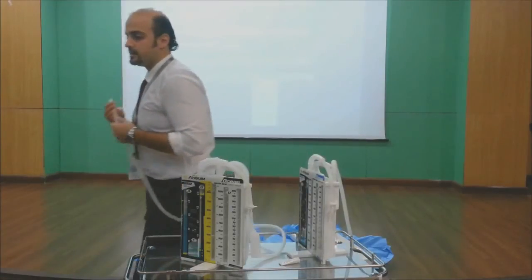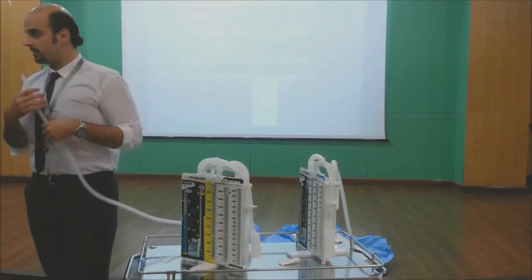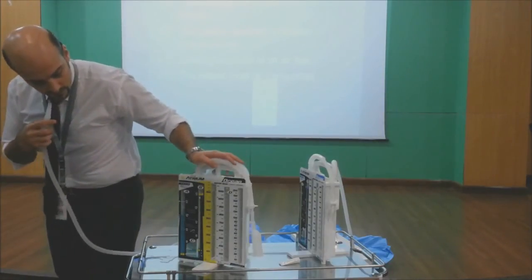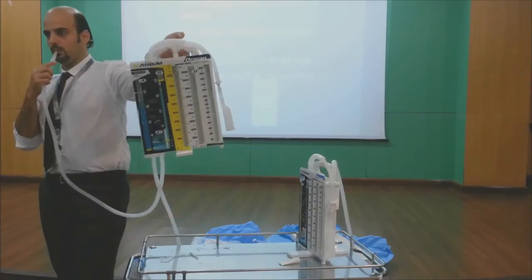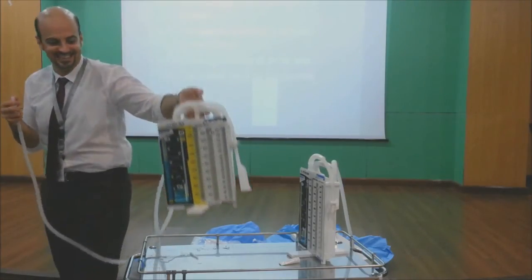So suppose I'm a patient, suppose this chest tube is connected to me, and I'm taking my breath. It's clean, I'm sure. See? This is a normal breathing.